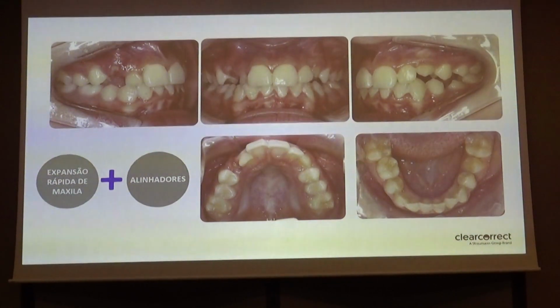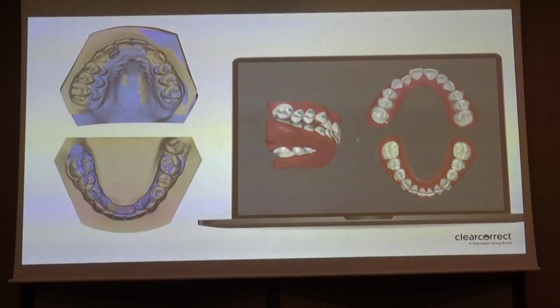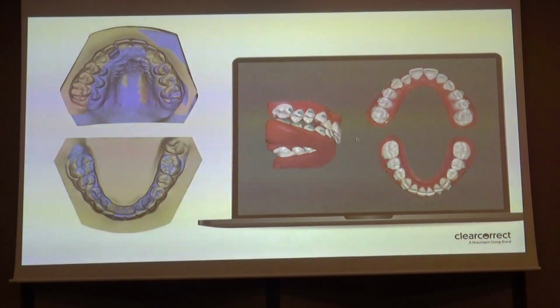Because the dental aspects would allow us to do only the ortho treatment, only the dental treatment. Bởi vì tất cả những cái mà mình chỉnh trên răng đó thì mình khí cụ mà khay thì mình sẽ chỉ chỉnh được trên răng thôi. And we decided for the orthopedic treatment. Cho nên là ở ca này thì hàm dưới mình sẽ chỉnh với khay thôi.